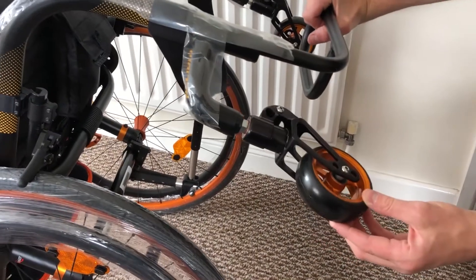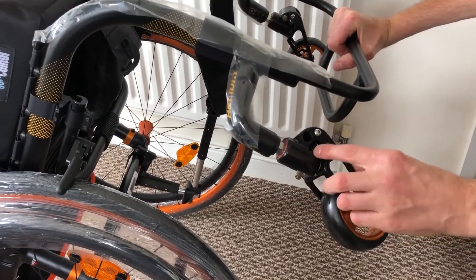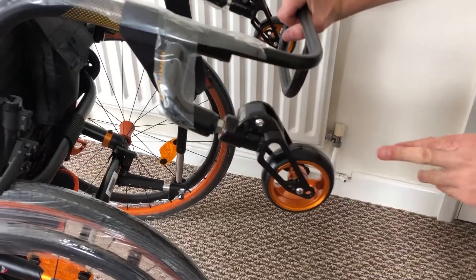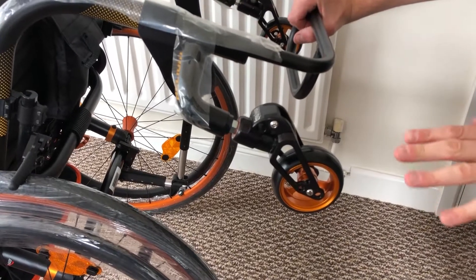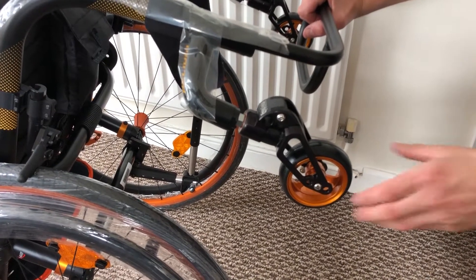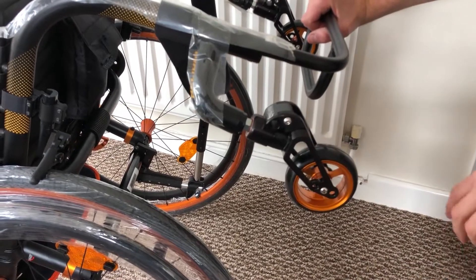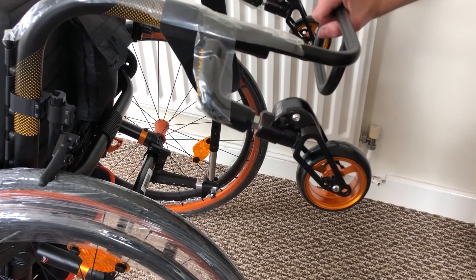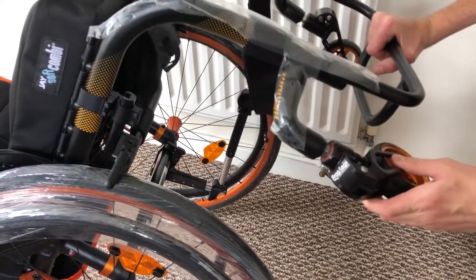These are the Frog's Legs casters — they have suspension built in. There's a suspension rubber, and when weight is applied through the caster wheel you get this little suspension which takes away some of the rough terrain and really does make a difference. They're aluminium gold casters which match the rest of the wheelchair, and if you're looking to make the ride as smooth as possible it is worth considering the Frog's Legs casters.